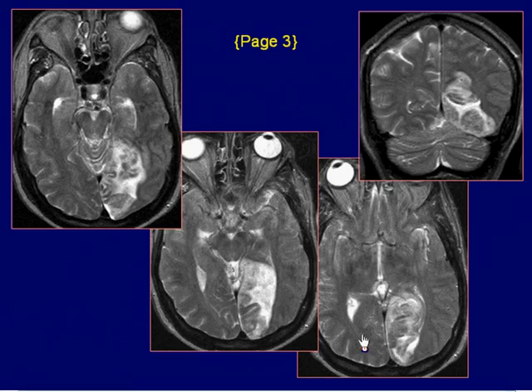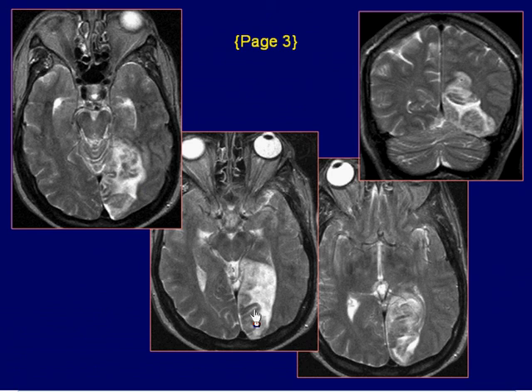T2-weighted MRI images of the same patient demonstrate left occipital lobe cortical gray and subcortical white matter hyperintensity with associated mass effect and effacement of the left occipital horn of the lateral ventricle.